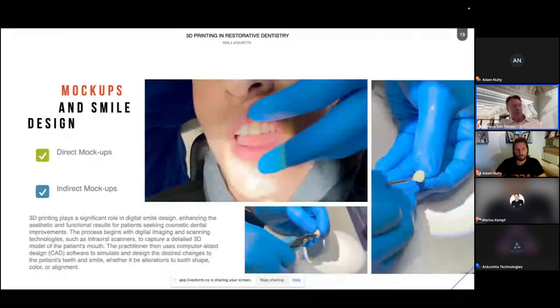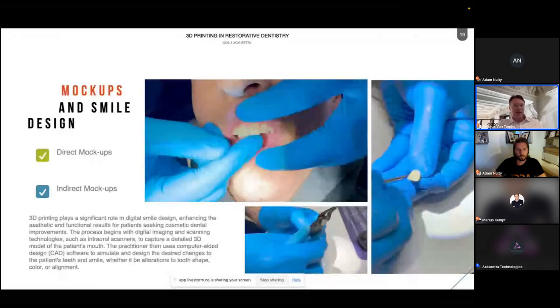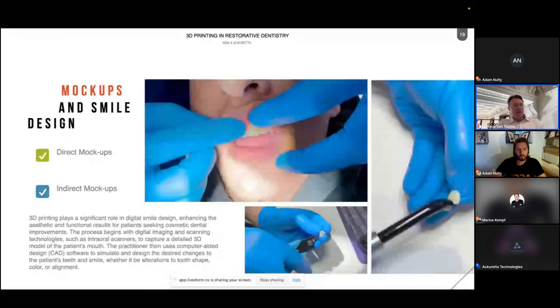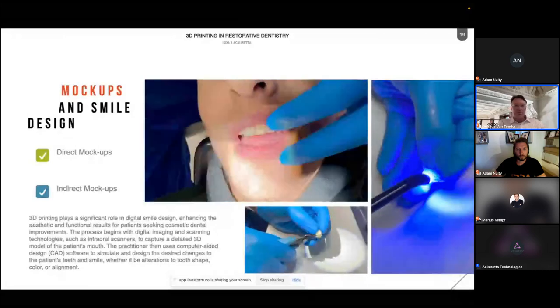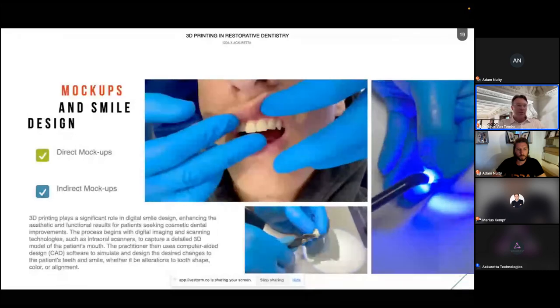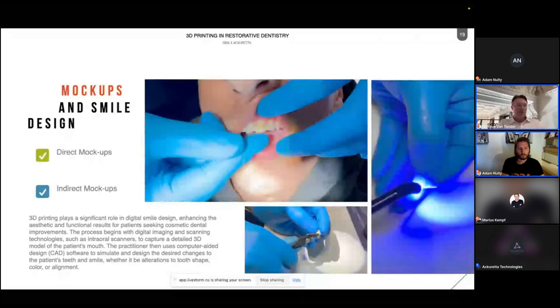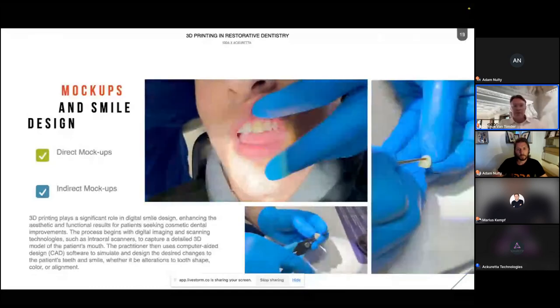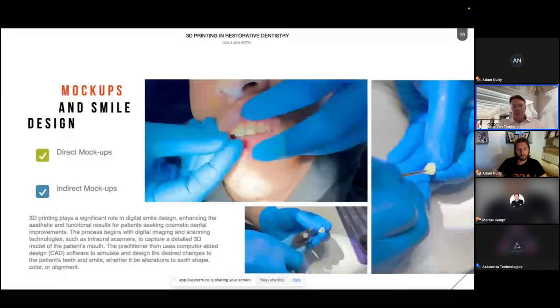And then if we look at mock-ups and smile designs as an application for 3D printing, you can do indirect mock-ups or you can do direct mock-ups. In this case, what you can see is we've mocked up this patient's two anterior teeth on exocad, and direct 3D printed those as a little shell that fits over the existing teeth to show this patient how these crowns or veneers will look and whether he's happy with that or not. So for this patient, we purely just used this as a mock-up.